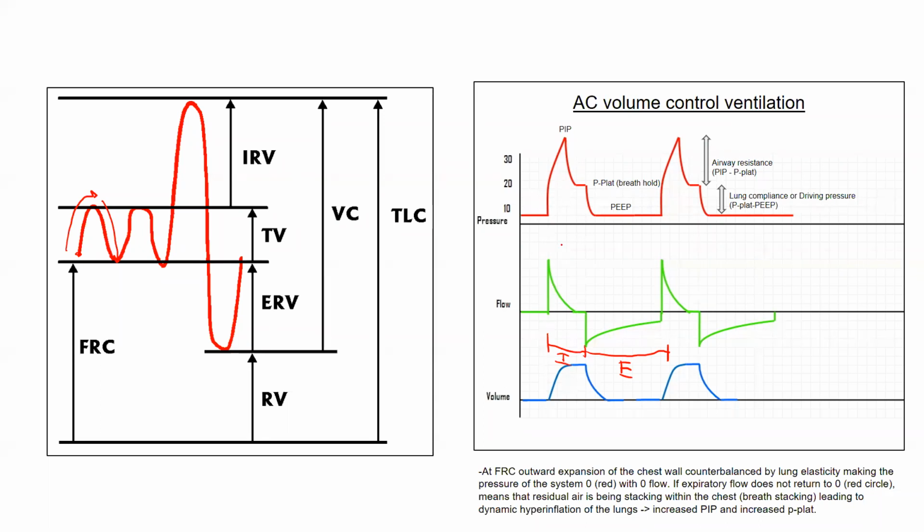If you don't expire the same amount that you inspire, you're going to have breath stacking. So everyone do this real quick. Take a breath, then take a much smaller breath out, then take another deep breath and a smaller breath out, and again. If you keep doing that, you can feel the pressure in your airways start getting higher and higher.